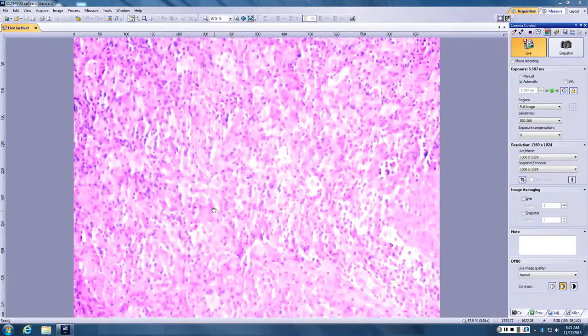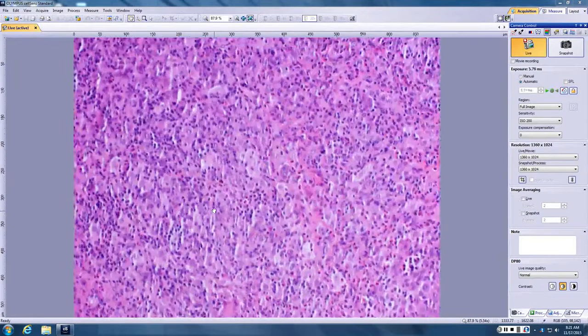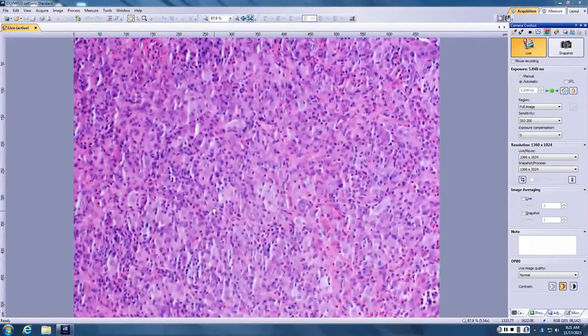So that makes you think of things like what? Xanthogranulomas and Langerhans cell histiocytosis are the spectrum that have the eos with the histiocytes. So you'd think of something in the xanthogranuloma spectrum, you'd think of LCH, so you'd probably get a CD1a.